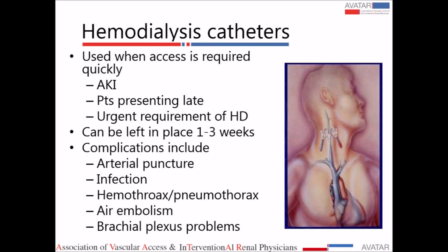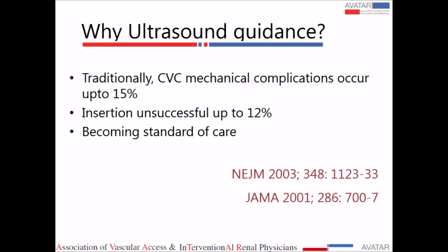So why should we be talking about ultrasound guidance? Traditionally, when we were using the landmark guided insertion of these catheters, the rate of mechanical complications was around 15%, and the insertions were unsuccessful in up to 12% of cases. Due to these reasons, to avoid or reduce the incidence of these complications, people have started using ultrasound, and nowadays this is becoming the standard of care.